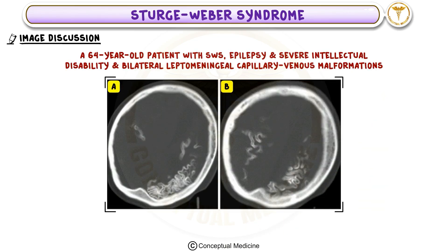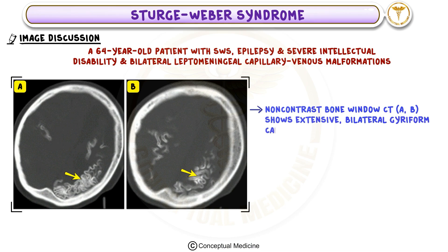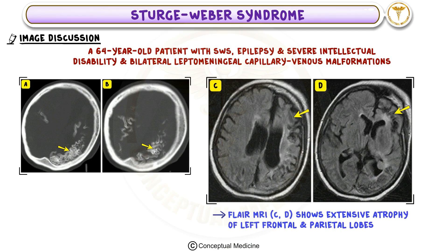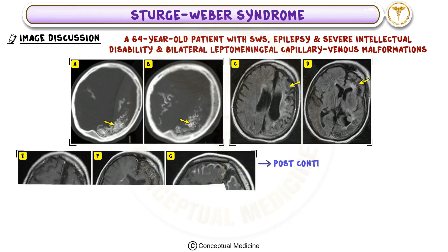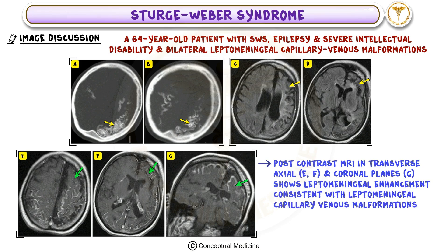Brain imaging of a patient with Sturge-Weber syndrome and bilateral leptomeningeal capillary venous malformations: A 64-year-old patient with SWS, epilepsy, and severe intellectual disability. Non-contrast bone window CT shows extensive bilateral gyroform calcifications in a curvilinear pattern, often called the tram-track sign. FLAIR MRI shows extensive atrophy of the left frontal and parietal lobes. Post-contrast MRI in transverse axial and coronal planes shows leptomeningeal enhancement consistent with leptomeningeal capillary venous malformations (LCVMs) in both cerebral hemispheres.